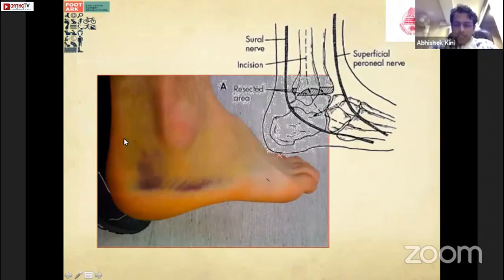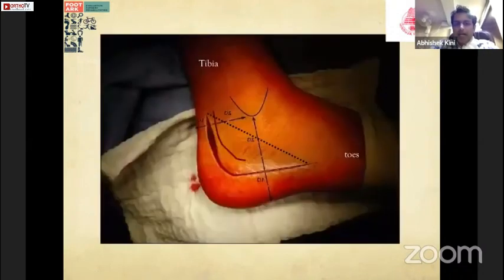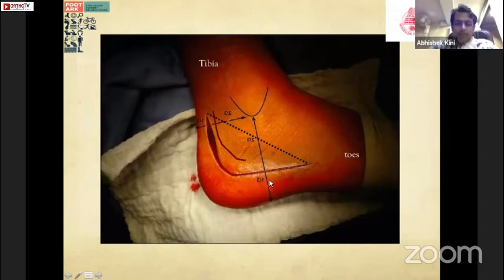When you are here, that's what the incision looks like. This is the point that I mark. This is where I extend. This is the top end and this is my incision. This is the tibia, these are the toes. I slightly obtuse it. I don't make sharp edges. I make it curved, which helps me avoid dog ears at the end.